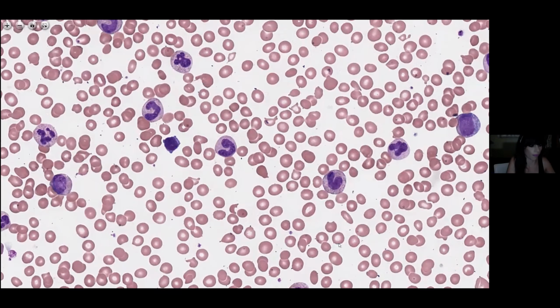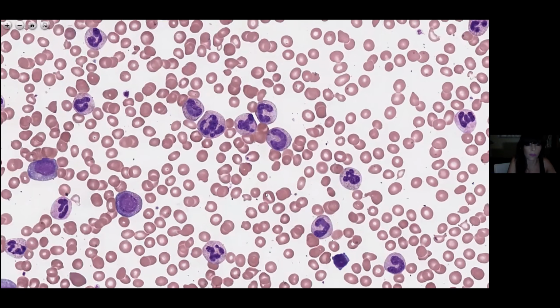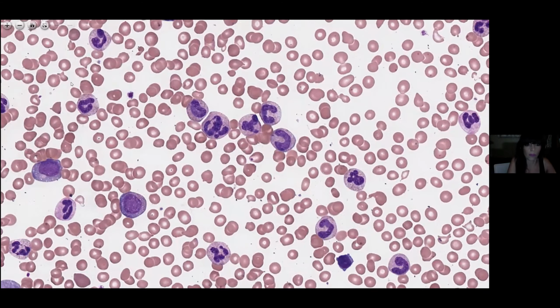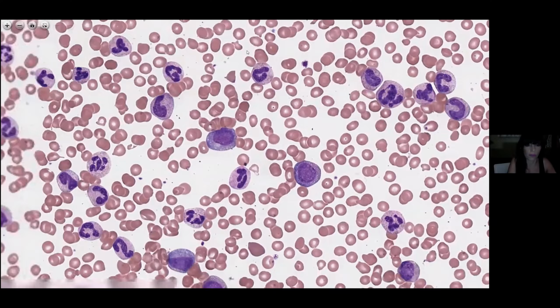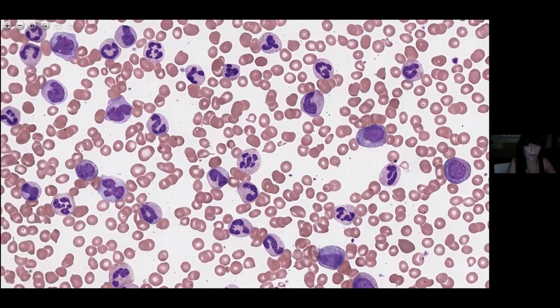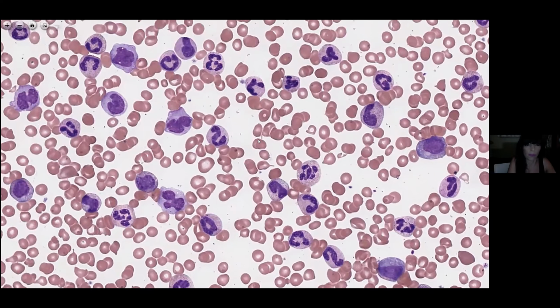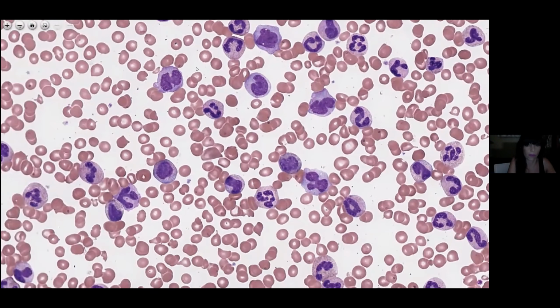And I think from a lab perspective, and I think it can be very challenging, but a very good differential count is really important because we need to know what the blast count is, because as we'll go through later, that will define what stage of disease that you have. Anything more than 20% is acute leukemia. Whether there's any abnormal lymphocytes there as well, because you can get accelerated lymphoid disease or blast crisis on the background of CML.